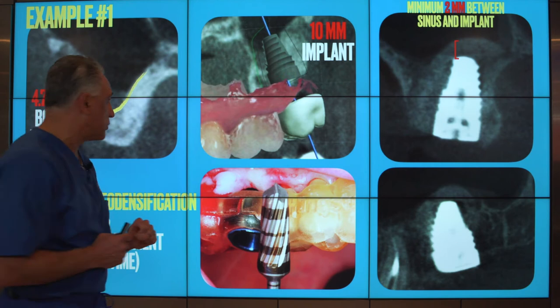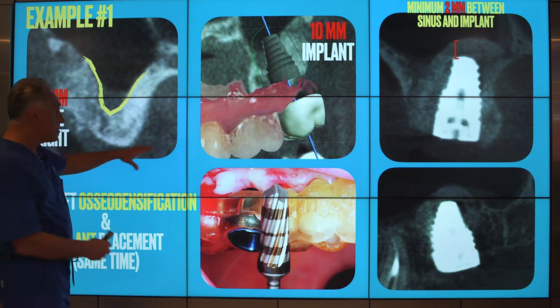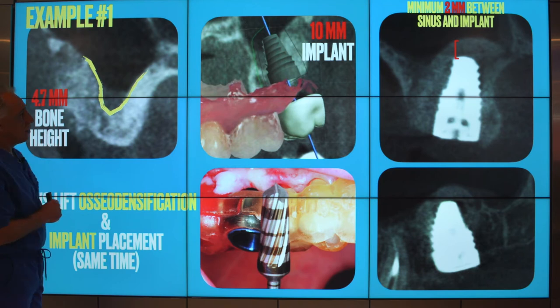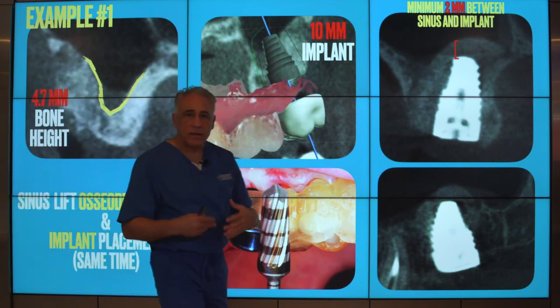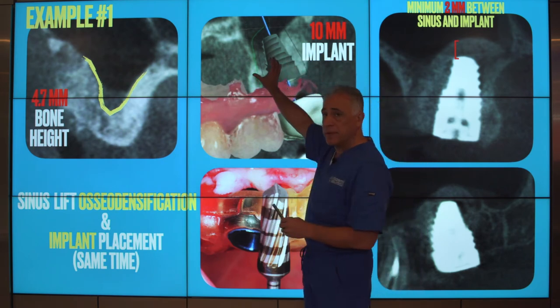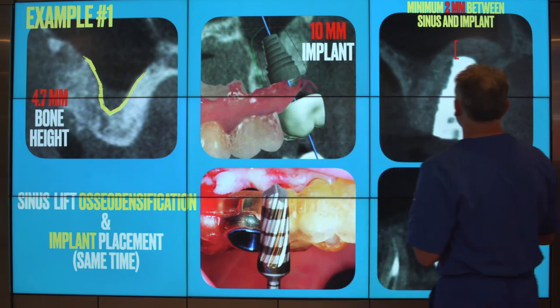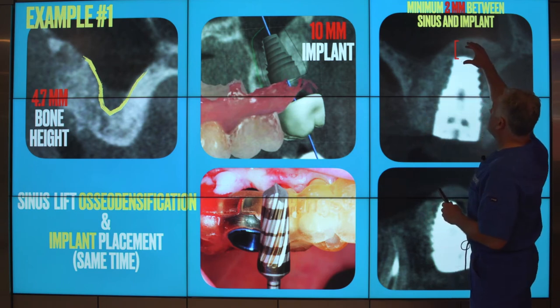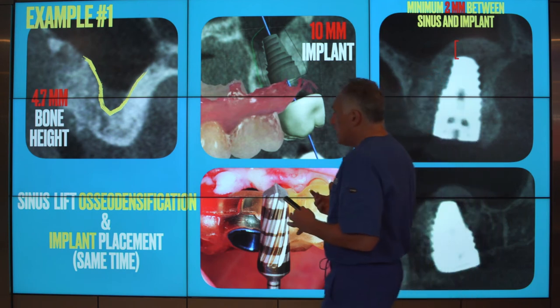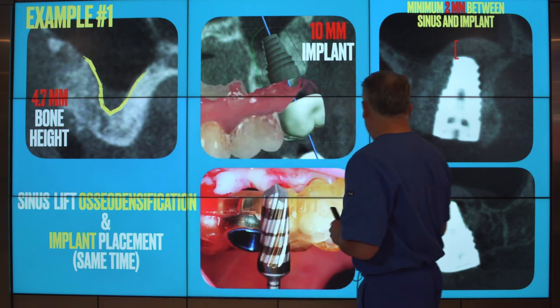Now let's look at a couple of examples. Here's a patient that presented with pneumatization of the sinus. There's inadequate height of bone. There's about 4.7 millimeters of bone height. And through our digital planning and computer-assisted implant simulation, we determined that we like to have a wider implant and 10 millimeters in height for proper support in this particular patient. And with a requirement of 2 millimeters of bone between the sinus and the implant, we need to have about 8 millimeters of bone augmentation.